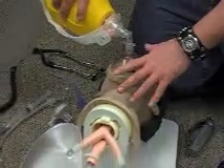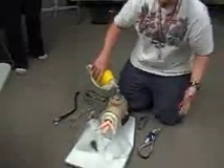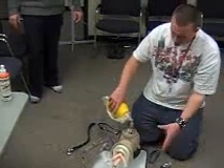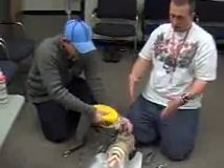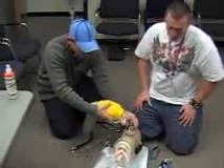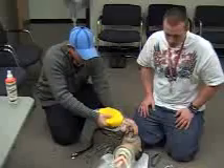I'm going to make sure that I have equal chest rise and compliance as I am bagging. I have now checked the ABCs — my patient is unconscious, I've checked his LOC. I'm going to pass this off to my partner. I've decided that as airway man I want to intubate this patient. My partner will begin pre-oxygenating the patient to the high end of normal, which will be 12 to 20, so about 20 breaths a minute.